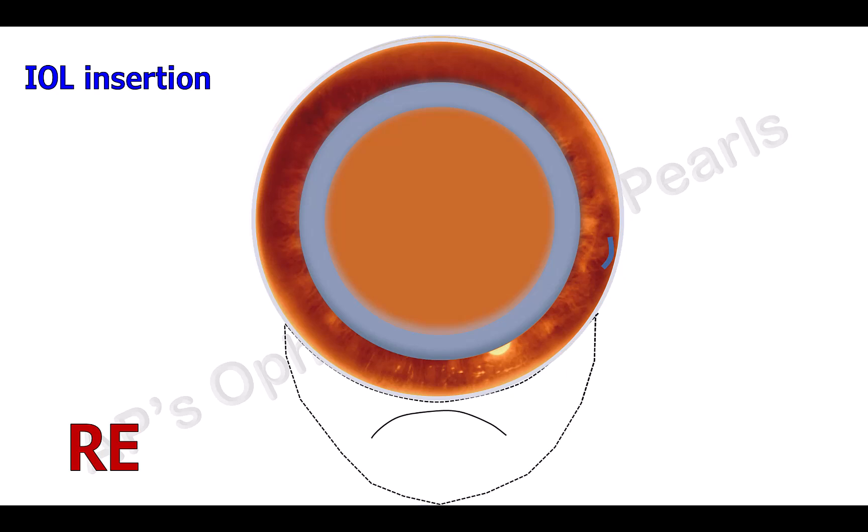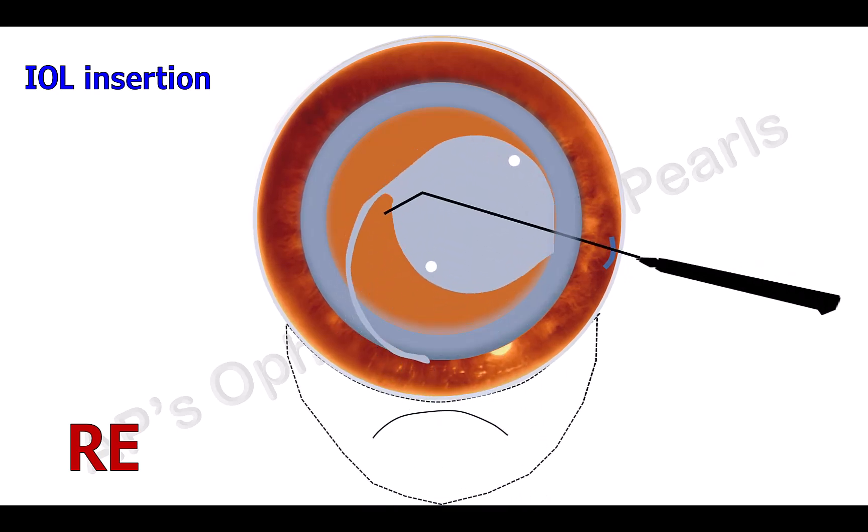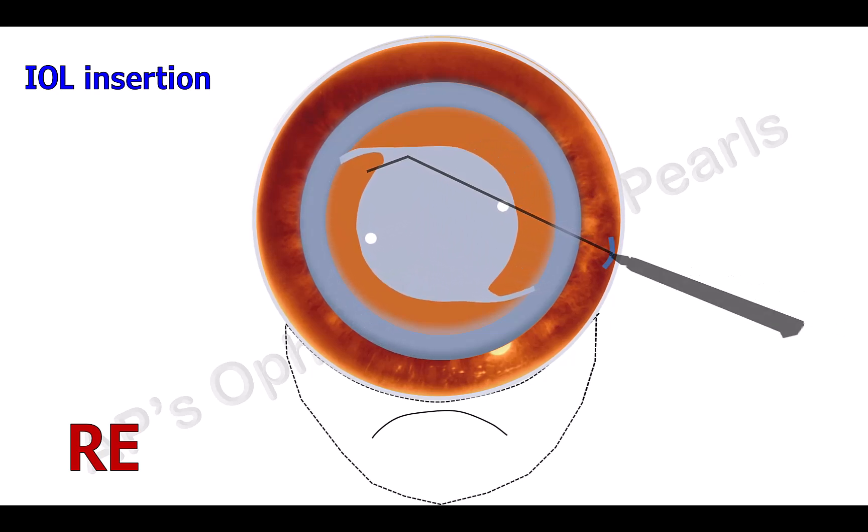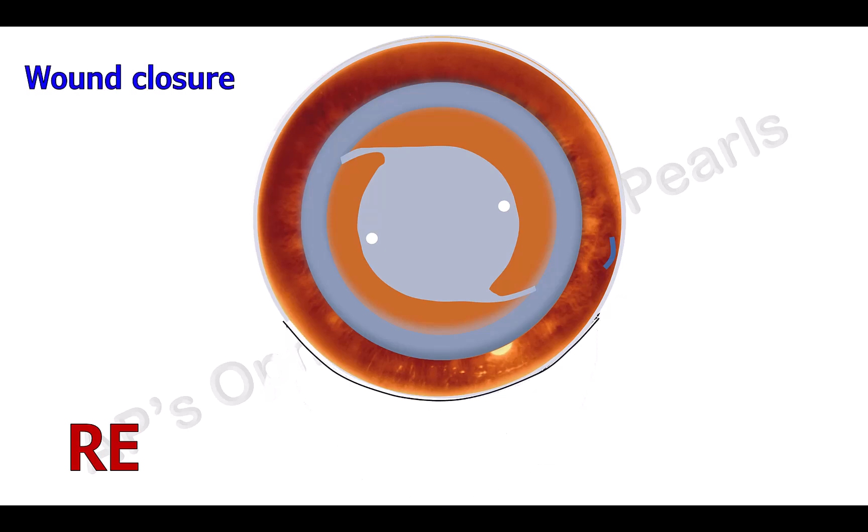Viscoelastic is injected and a posterior chamber IOL is then placed in the capsular bag and rotated into place with the help of a Sinskey hook. Viscoelastic is removed. The side port is closed by stromal hydration. The conjunctiva is reapposed with the help of a bipolar cautery. An antibiotic and steroid is then injected subconjunctivally.